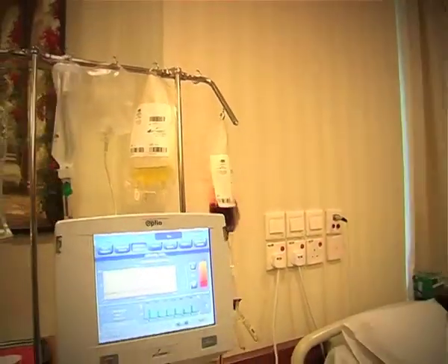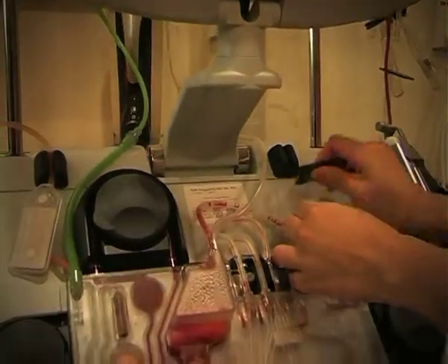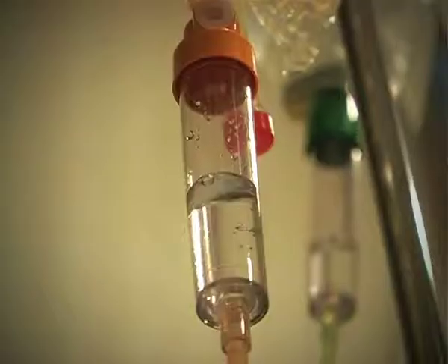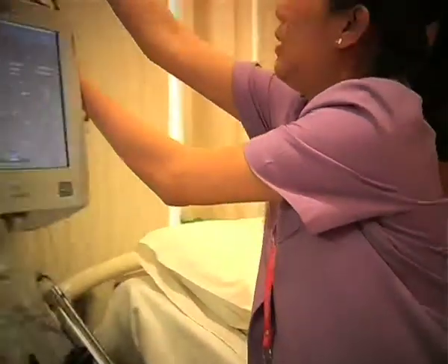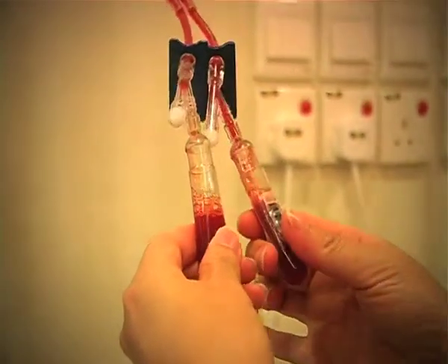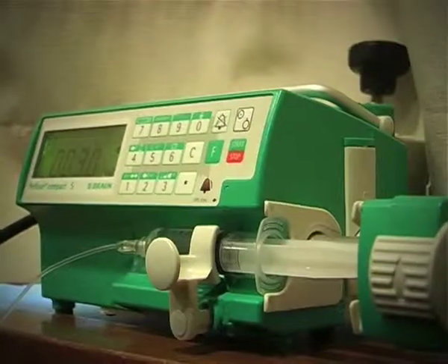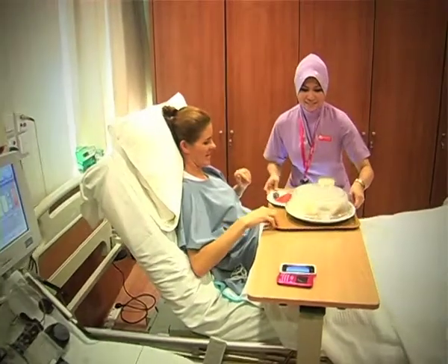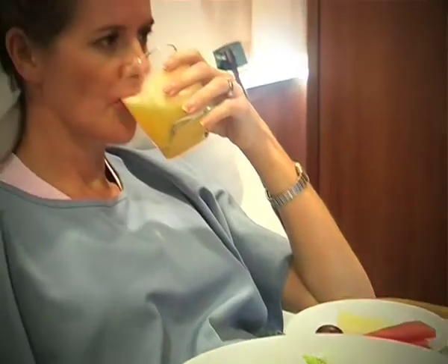Complications are minimal. However, some patients may feel lightheadedness, especially at the beginning of the procedure. To prevent blood clotting, an anticoagulant, such as an acid citrate dextrose, is added to the cell separator. This may result in symptoms of pins and needles in the fingertips or lips, palpitations, or a feeling of being unwell. These symptoms can be minimized by the calcium supplements taken prior to the procedure. Harvesting process takes 2 to 3 hours, during which you may read a book or have a light meal.